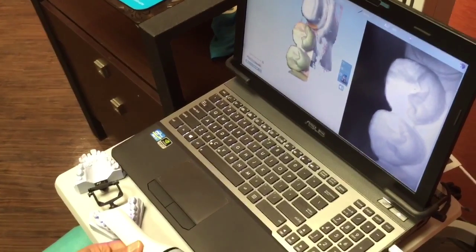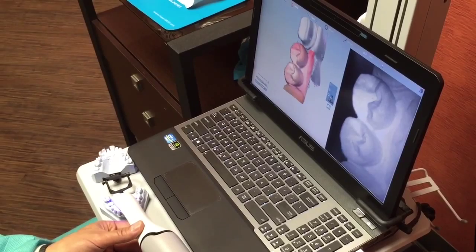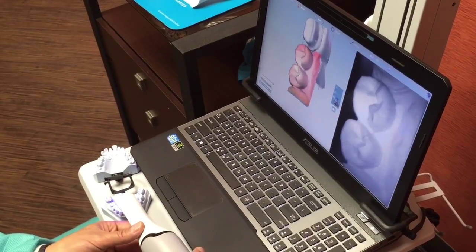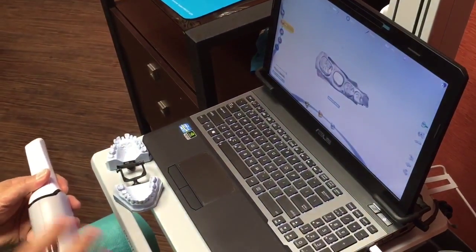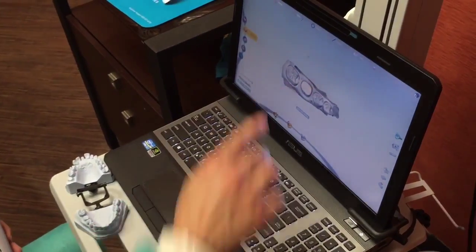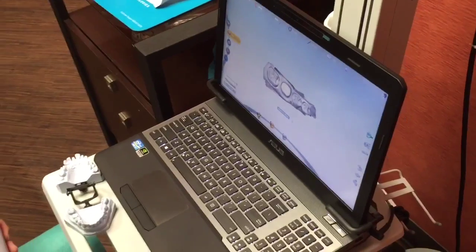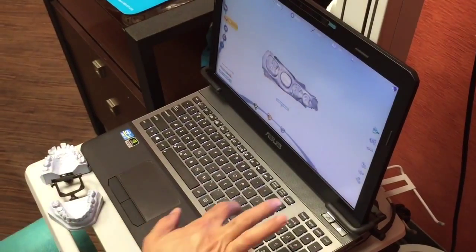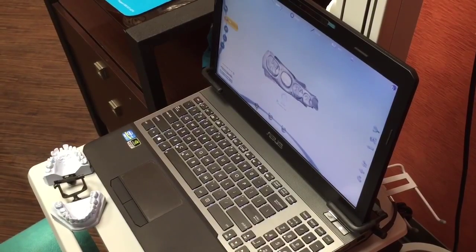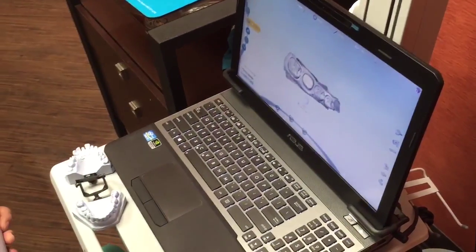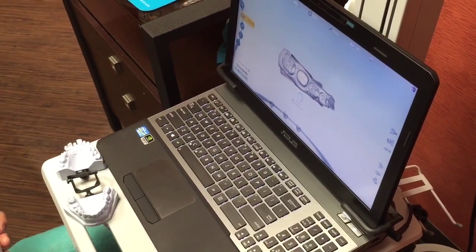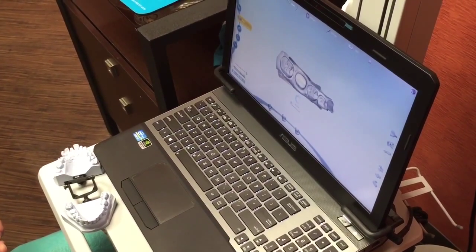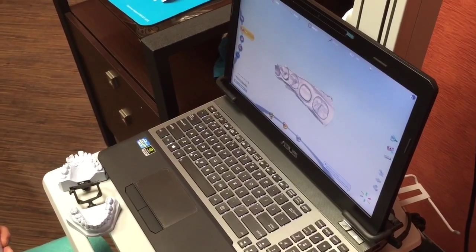And once you're done, you can see what you're doing here. See where the orange color is? I just press this and it stops. See how nice it did that? Then, when you're in this mode, you press Generate Model. Or you can press M. Enter. What that does, it generates a model from the digital image you captured. See what it did? Man, that was nice. I like the new software.